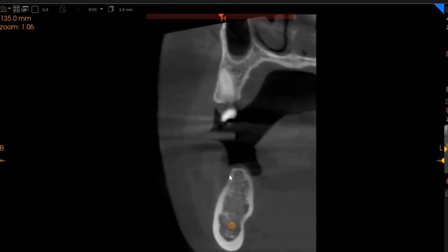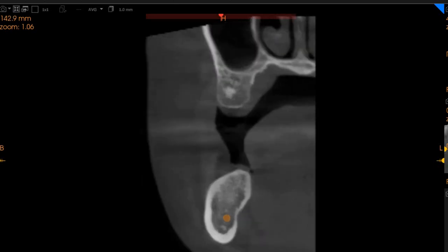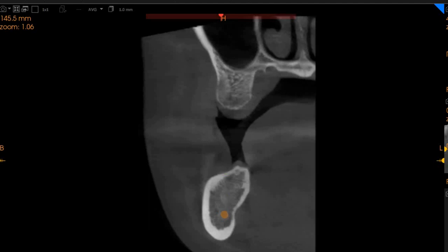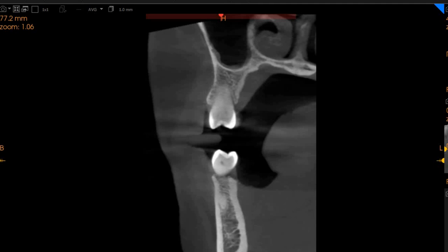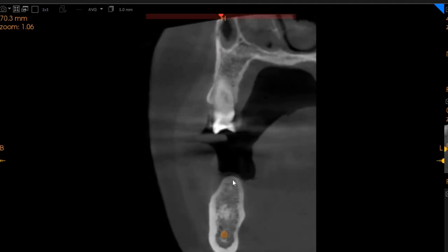Moving to the lower left segment, this is the region of the six. We've got a slightly thin ridge, but if you place a deeper implant you've got 7 millimeters of ridge width with a good 15 millimeters of height. In the seven region, we've got approximately 8 millimeters of width with a good 13 millimeters of height, so a shorter and wider implant can be placed here, and even a longer one.